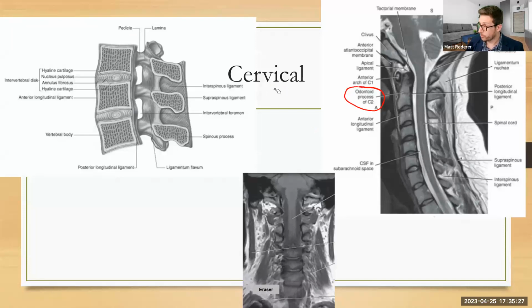There's a total of 7 vertebrae in the cervical spine. This is number 2. The reason it's so important is that it looks like an arrowhead. I like that, an arrowhead. And it's important to identify because this is how we make sure we have all the vertebrae when we're taking images. I don't know if I have all the cervical spine images unless I can count them.